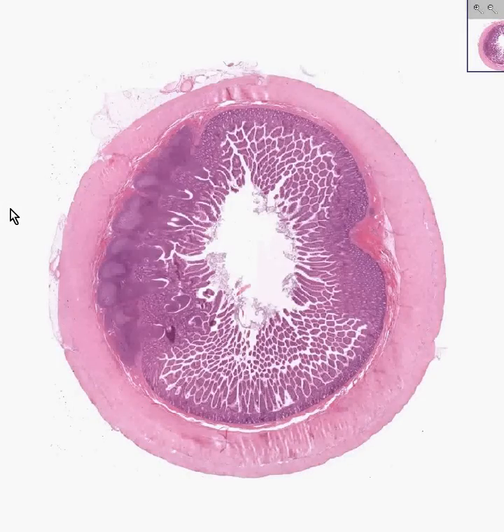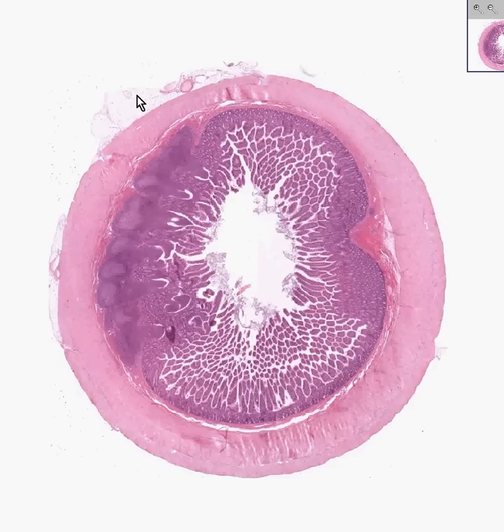The small intestine is another classic example of the overall organization of the four layers of the gastrointestinal system. Like most other gastrointestinal organs that have a lumen, we have a mucosa, a submucosa, a muscularis, and a serosa. Virtually the entire small intestine — jejunum or ileum — is covered by peritoneum and is intraperitoneal. So if you look closely, you may see some mesothelial cell linings on the surface.